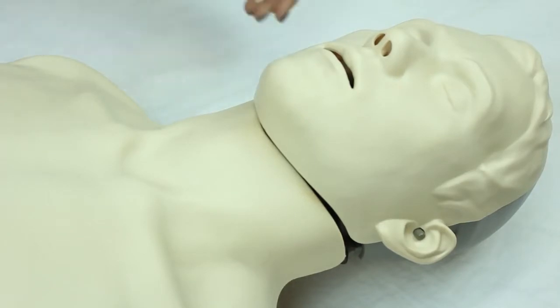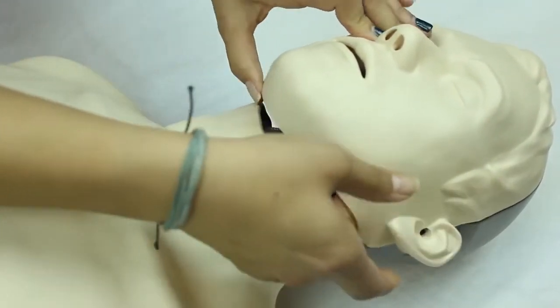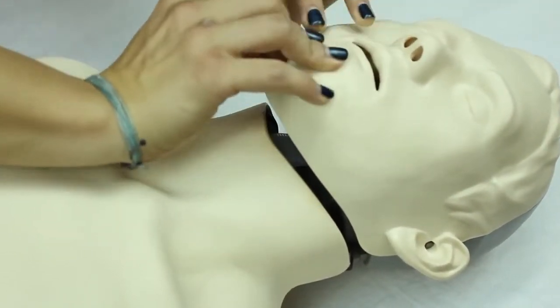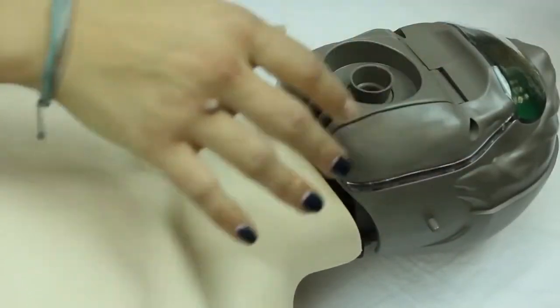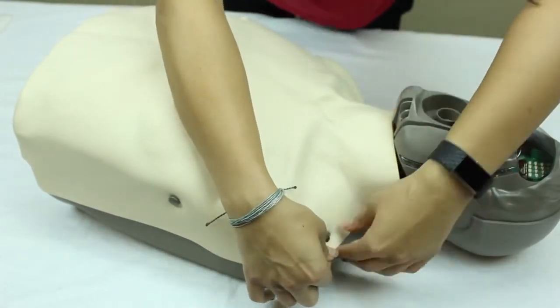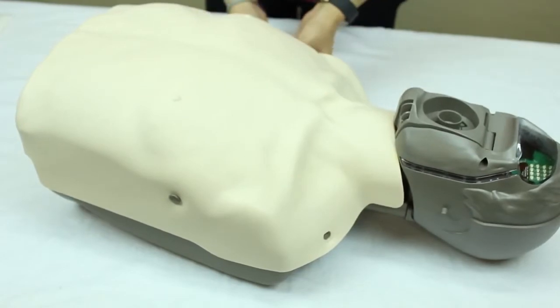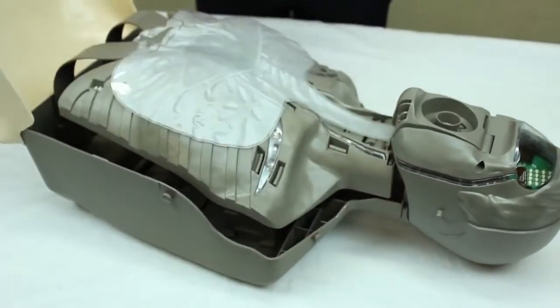To change the lung bag, first take off the face skin by unlatching it on the knobs and pull it up. Then take off the chest skin by pulling it over the knobs located on the shoulders and on the side of the ribcage and peel it back.